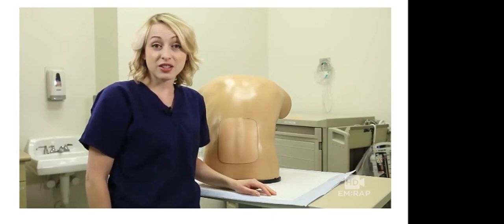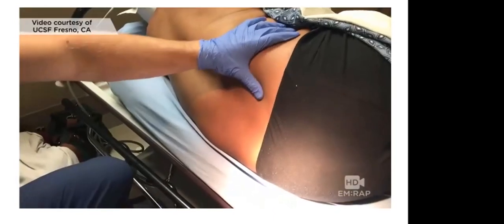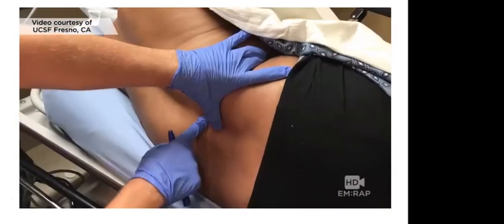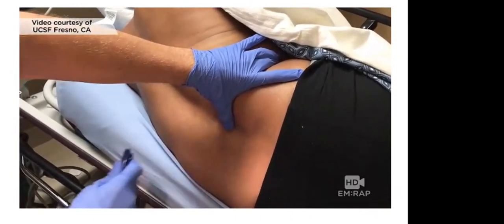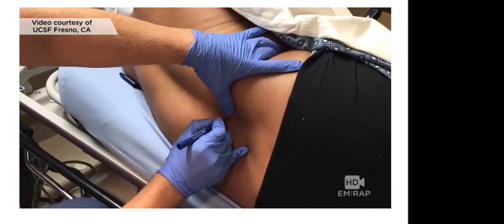Let's take a look at the real procedure done by Dr. Jordan Harp. Whether the patient is upright or lateral recumbent like this patient, identify the landmarks by palpating the posterior superior iliac crest, and where they meet in the midline should be L4, which is good. That's below the termination of the spinal cord, and we don't want to poke the spinal cord, so place a mark at this level. Clean the skin with antiseptic solution, and drape the patient to give yourself a sterile field.